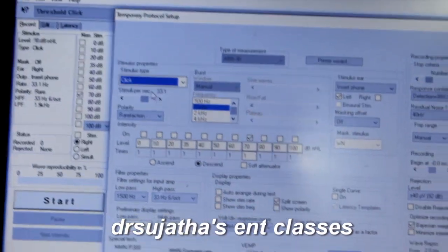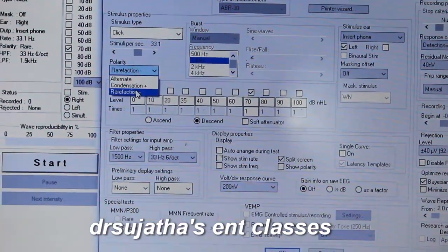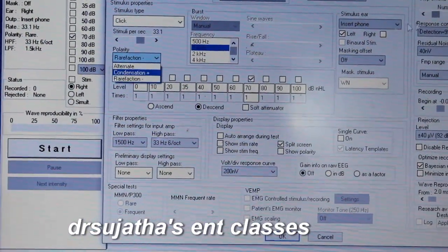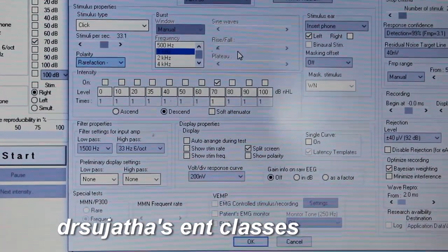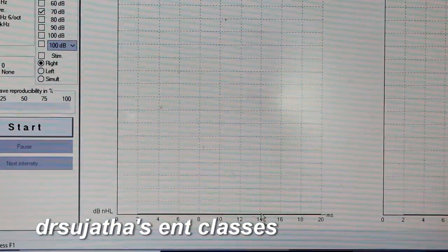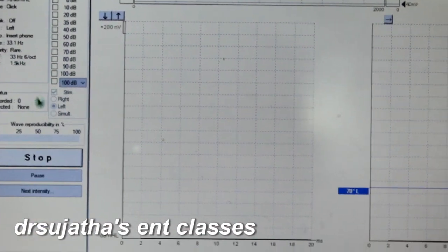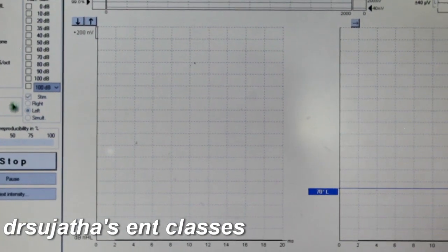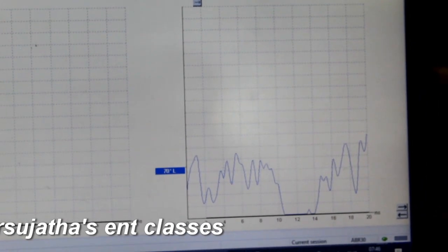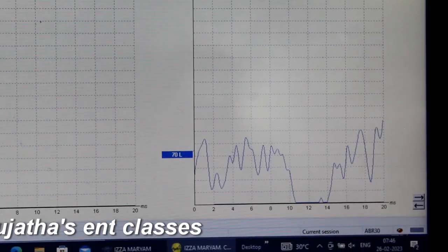And this one is the ABR test screen. And you can split your screen to left and right. And here we give 70 dB. We can select the stimulus intensity. We are giving a 70 dB click stimulus for air conduction. First, air conduction is tested. And on giving start, on giving the stimulus, the wave pattern will appear. Here you see post-auricular muscle artifacts are there. That is why it is coming like this. In that case, adequate sedation should be given and the test should be repeated.